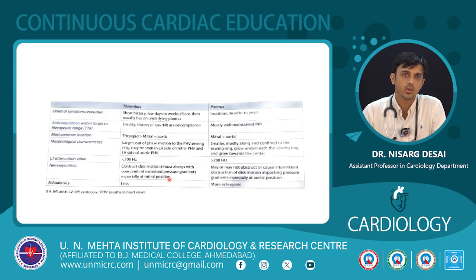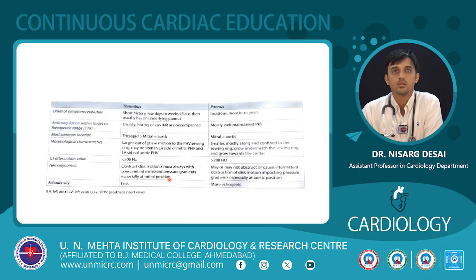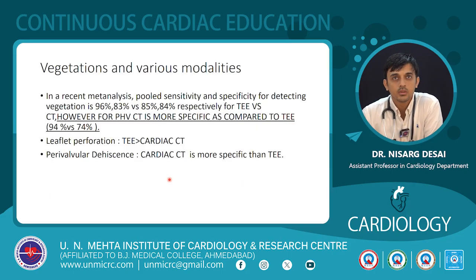And talking about the hemodynamics, thrombus will usually obstruct the disc. Thrombus will obstruct the disc motion, and the patient will have symptoms acutely, whereas pannus may or may not obstruct the valve and usually may or may not have symptoms related to the obstruction.